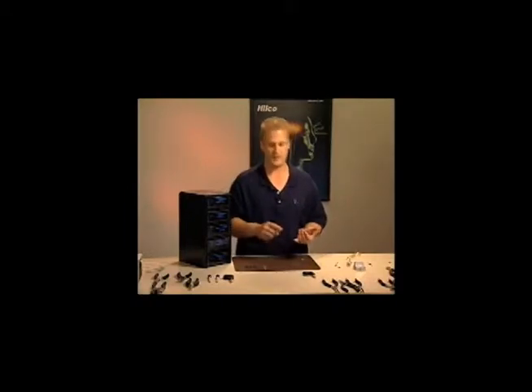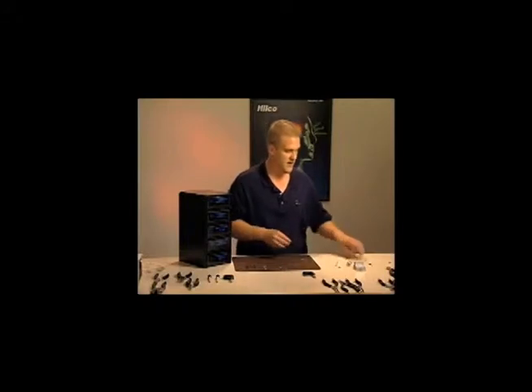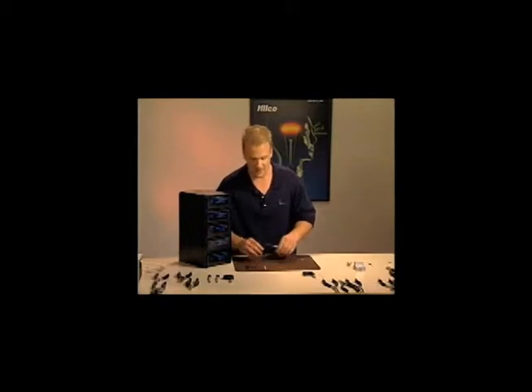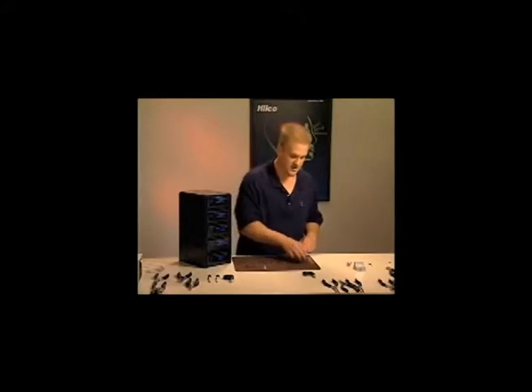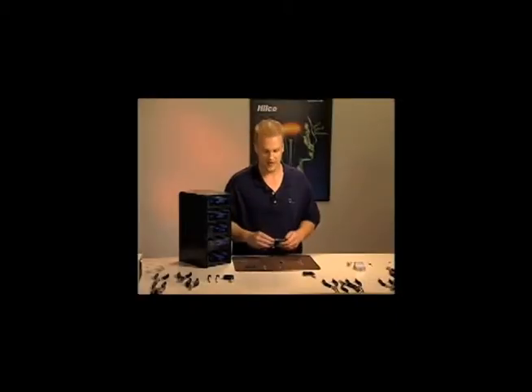Now that we've removed the screw from the frame and we haven't damaged the hardware, either we used a ribbon file or were able to get it out with a screwdriver and the hot fingers, or using the screw extractors, we need just a replacement screw to put into the frame. And one thing to keep in mind is that in today's optical industry, 1.4 millimeter is by far the most popular diameter used in both the hinge and the eye wire. That's a great starting point if you have no other means to find what screw you need for the job at hand. But there are gauges out there, such as the Fast Find screw and hole gauge, with which you can quickly find what diameter screw you need and the length, and it works very simply.